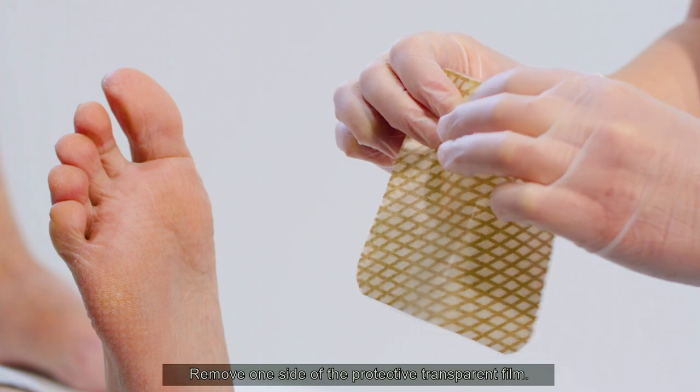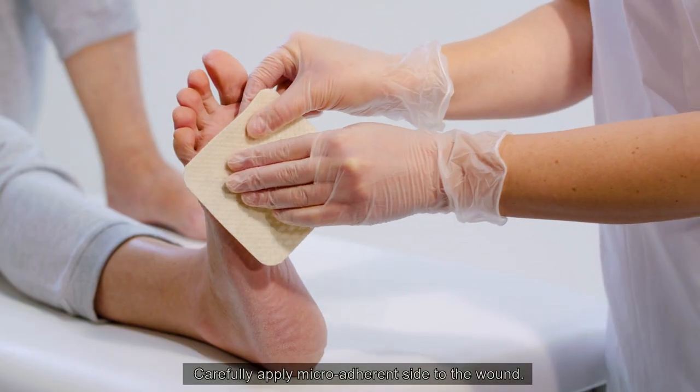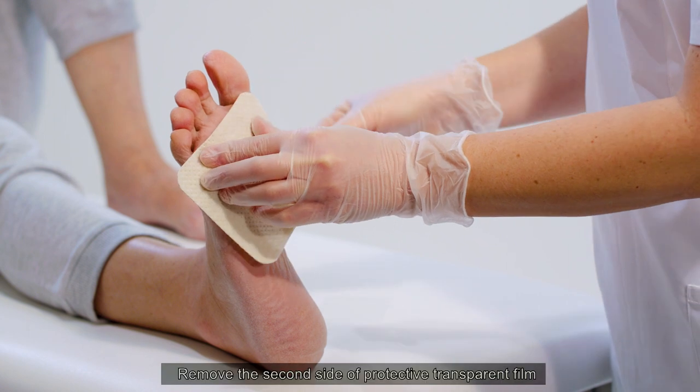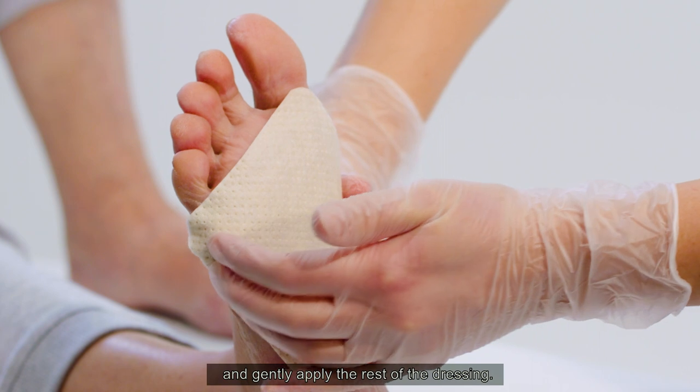Remove one side of the protective transparent film. Carefully apply the micro adherent side to the wound. Remove the second side of protective transparent film and gently apply the rest of the dressing.